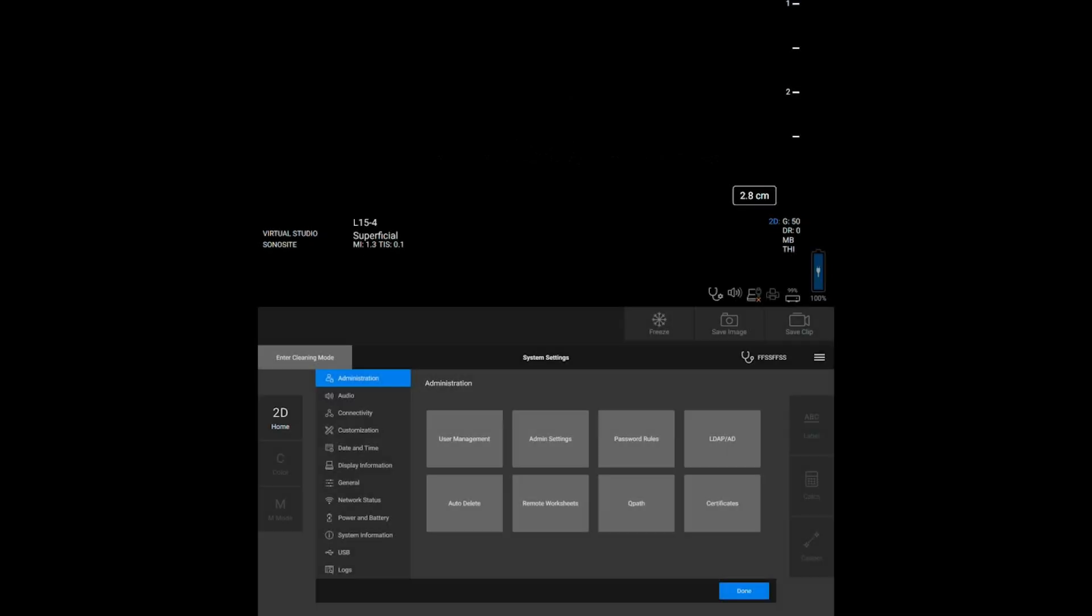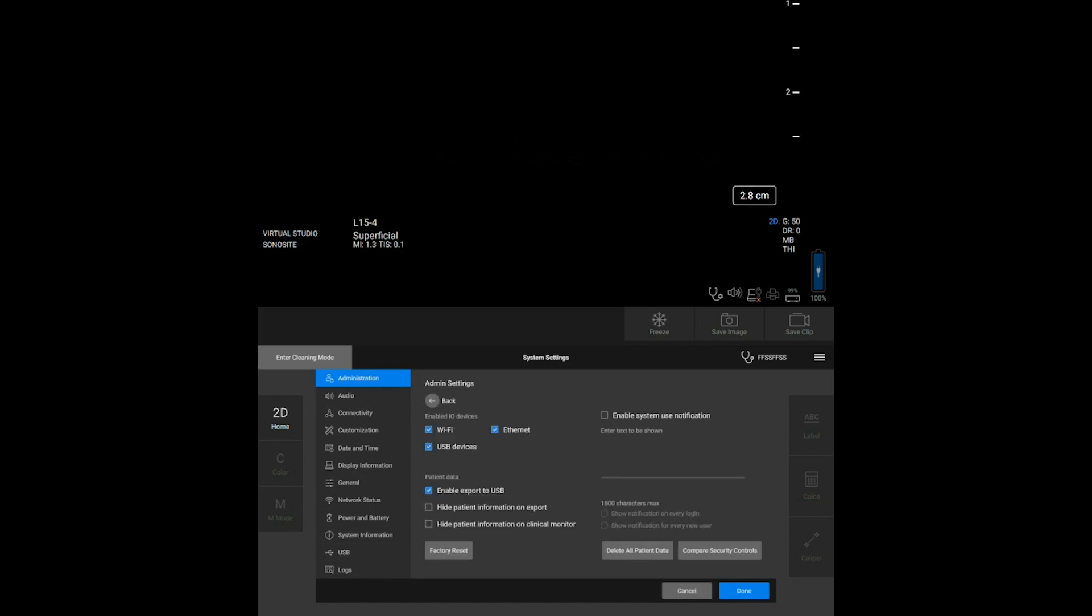As an administrator, you can configure the system to protect patient information by disabling the USB export feature or by hiding patient information in exported data or on the screen.